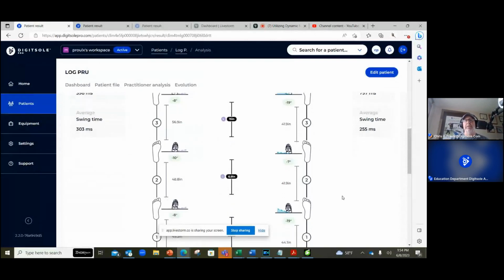And this is where we get to see a comparison between the right and the left, and it tells us where the advantage is. So by 15 inches on that last one, and that really skews it. So take that into consideration, and why you might want to do, what we find in research, is we do three trials, because 80% of people will typically perform the best on the second trial.